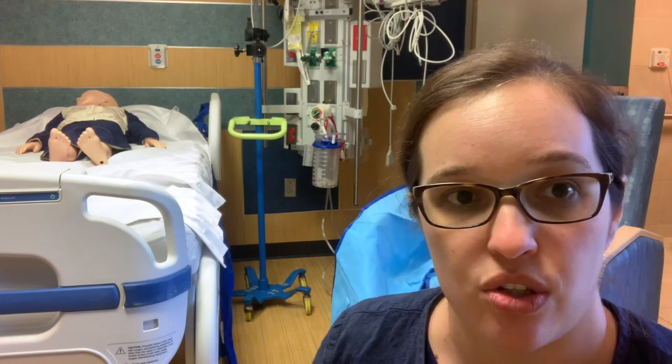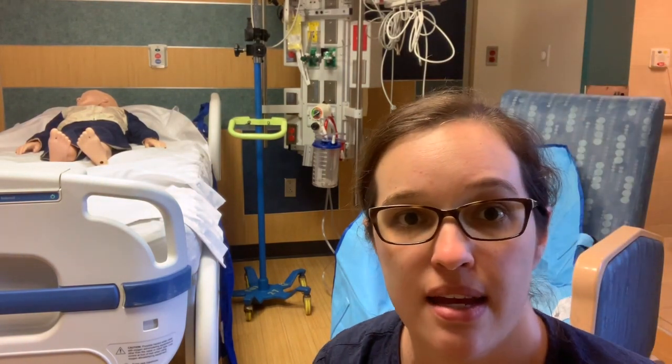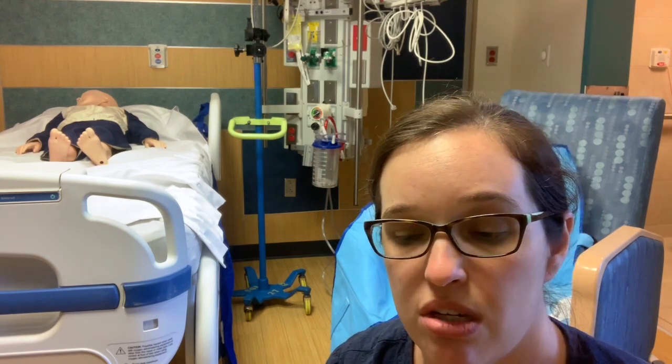Hi! This is the MaxiMove video to show you how to use the MaxiMove safe lifting device with the Hoyer lift attachment on it. A couple things to remember: your support sheets come in three different sizes. There are max weights listed on each of the sizes, so make sure you look at that and make sure it's appropriate for your patient prior to use.